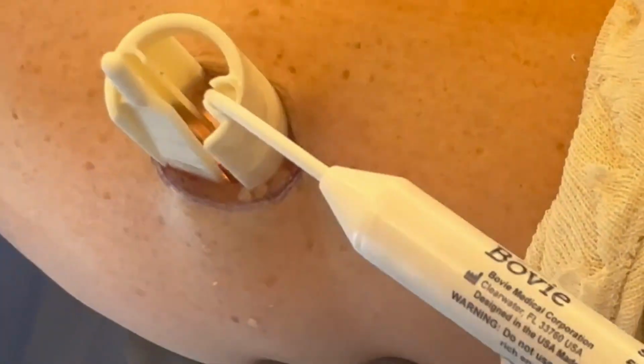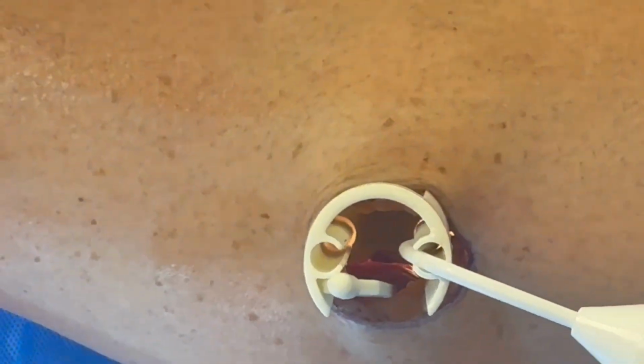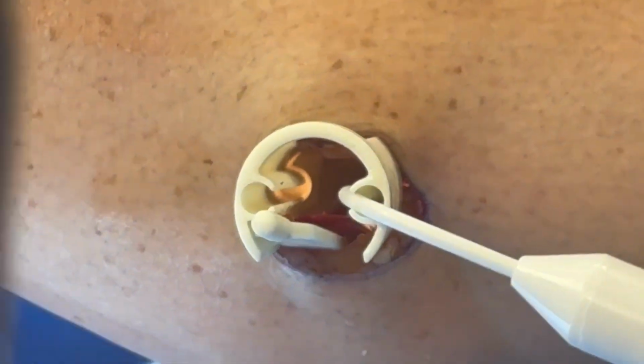It's important not to cut the deep fascia. It makes closure of that more difficult. This also helps to protect that as well. And with the light in there, you can readily see if you have a complete release or not. I do like to check.